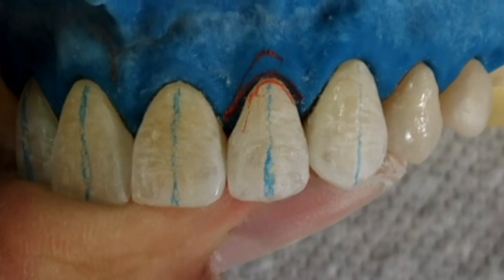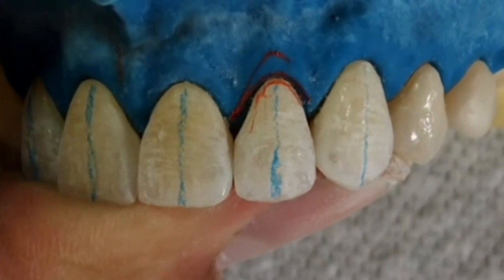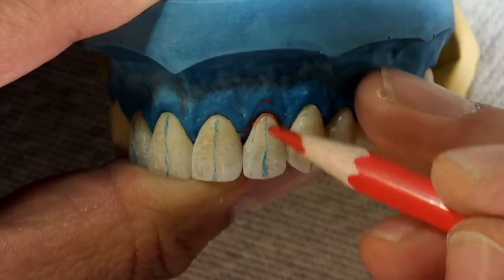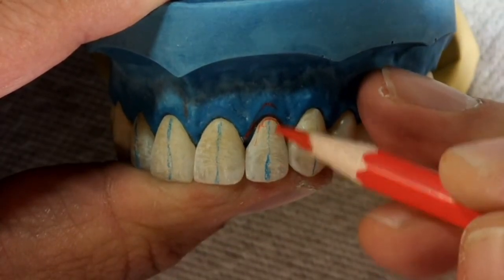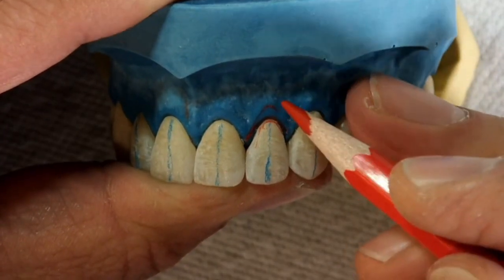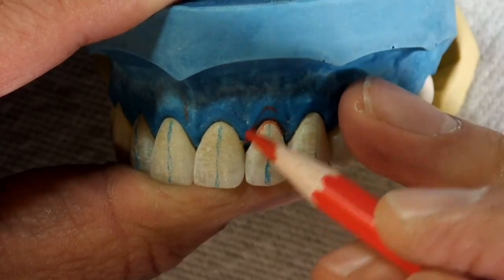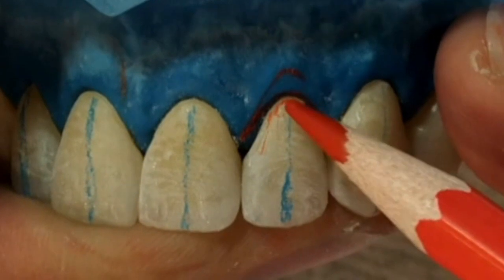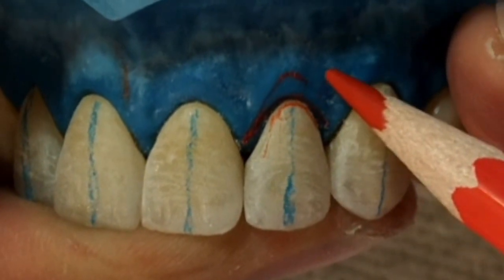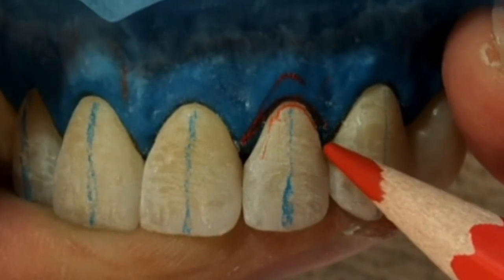I usually draw directly on the crown for better visualization. The lateral incisor zenith coincides with the long axis of the tooth, whereas the zenith of the central incisors and the canines are slightly distal to the long axis. Therefore, when we draw the long axis on the tooth, we start at the center of the incisal edge and draw a line down to the gingival.